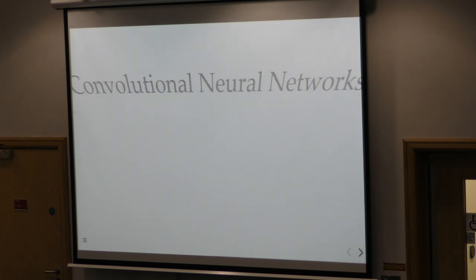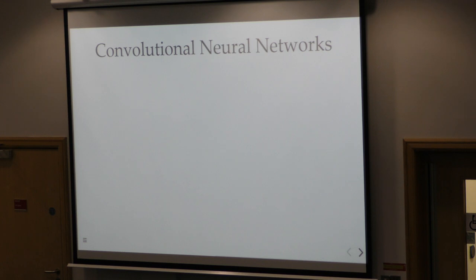And that black box that we use is a convolutional neural network. This diagram, which I will show you now, seems a little bit complicated, but it's not really when you break it down into 2 tasks. So again, what we want is on the left our medical image, which we use as our input, and then on the right our segmentation maps. So a segmentation which identifies particular regions in that image that we're interested in.